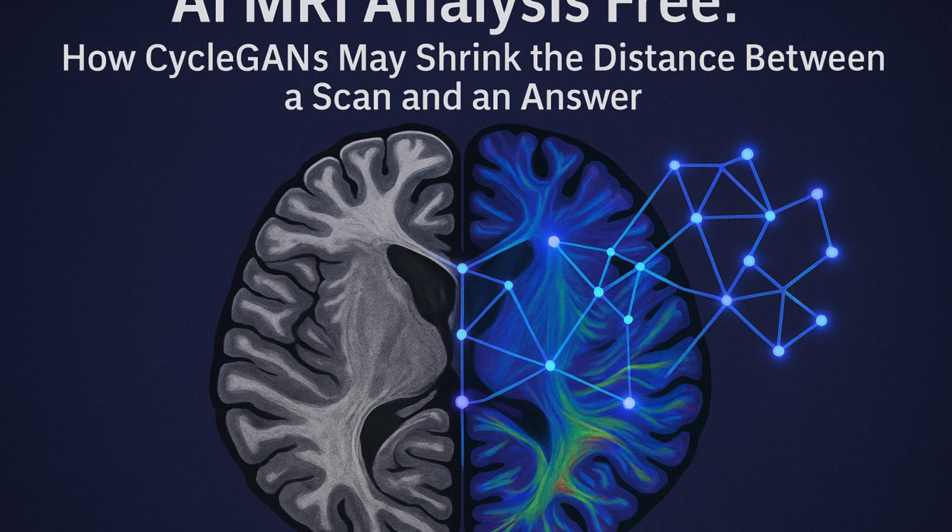Free online diagnosis, especially asking for payment details, is highly suspect. Okay, so given all that, who actually stands to benefit most from the AI MRI tools we're seeing now, especially the free or research-focused ones? Let's think about specific cases. Rural hospitals came up. Right. How could they benefit? Well, like we discussed with CycleGANs, if they lack diffusion sequences, a tool that generates FA-like info from standard scans could be incredibly valuable. It gives clinicians more insight without needing costly referrals to bigger centers.